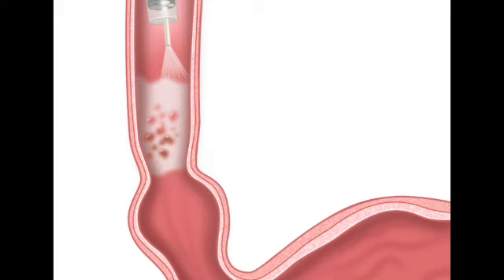Okay, what's that? Well, we are talking about spraying acid into the delicate lining of the esophagus, onto the walls of the stomach, and directly onto open scars in the colon. Right. The mechanism is brilliant, but surely this level of chemical manipulation comes with some heavy collateral damage to the patient. What are the actual side effects of doing this?